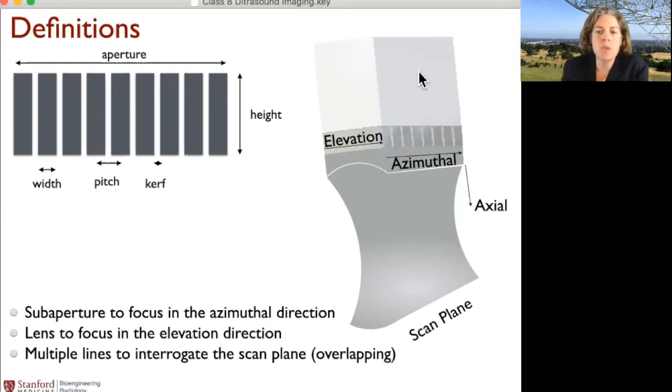And then as long as you know where the handle is, like you could put some markers on it, then you would know where those planes were, and then you could just interpolate into a 3D grid. Interesting. Yeah, it's a good question.